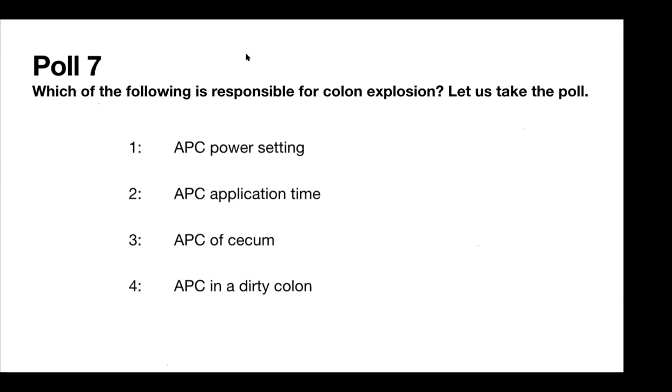An enema doesn't prevent the methane from forming. Right. So we always use CO2, everyone. Right. So do you prep them like a colon prep, or do you do just a fleet enema? We'll do it with just a fleet enema and CO2. But you know, explosion's unlikely, but we've never had one and hope never to have one. But if we had one, we would never report it. Okay. Yeah, but it's a scary thing.